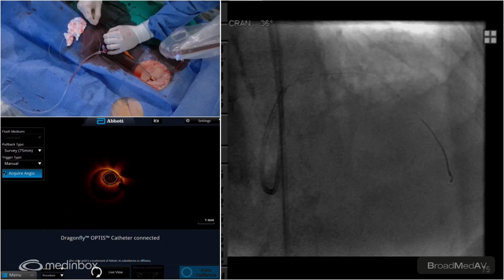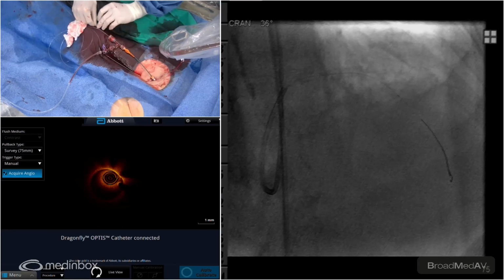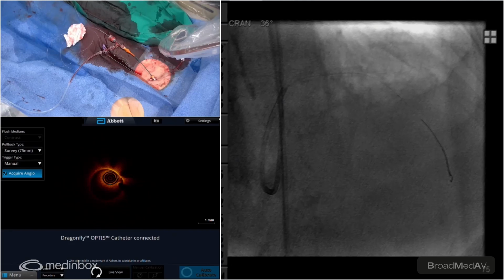The challenge with this is you're on a workhorse wire and the RX on that angulation. Yeah, I can see the bend getting on there. So for those of you who can see up top, every time you go into the short RX, it's just going to always recoil like that. Leave that in. Yeah, 6 French will fit beside that. Yeah, we're on a 7 French guide. I think it gives us enough room just to get it through the ostial LAD.